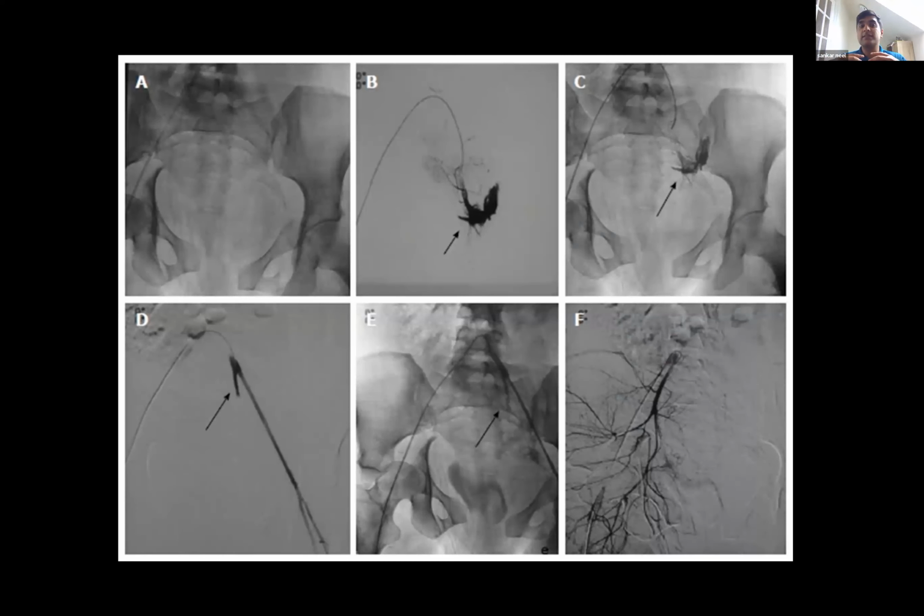Unfortunately, we didn't have a case. I mean, at least I have not done a case where I've used gel foam for the pelvis, but this is a case that I got off the internet in a reputed publication, where essentially this is bleeding out of the internal iliac artery on the left. And as you can see, that's significant ooze, and it's an active hemorrhage.